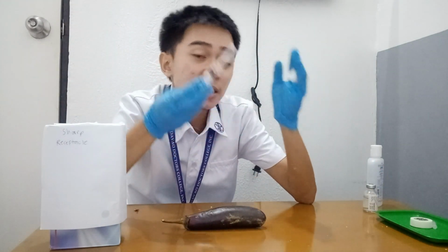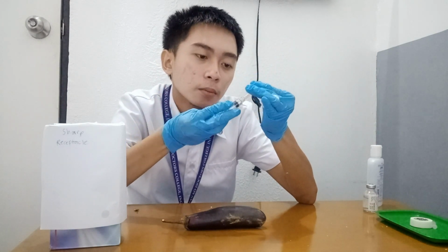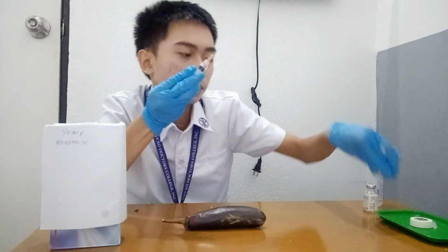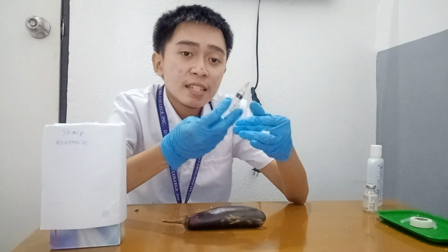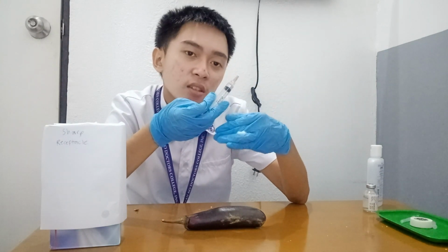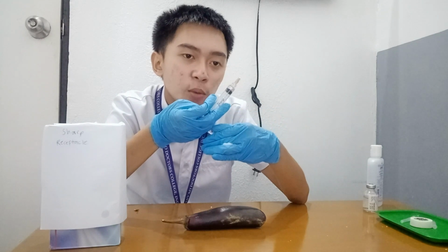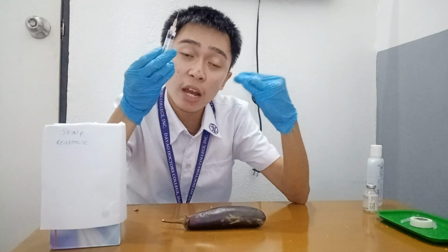So we are going to get the syringe and remove the needle cover and discard without contaminating the needle. If using a pre-filled unit dose medication, take caution to avoid dripping medication on the needle prior to injection. If this does occur, wipe the medication off the needle with a sterile gauze. Inject the medication using the Z-track technique.